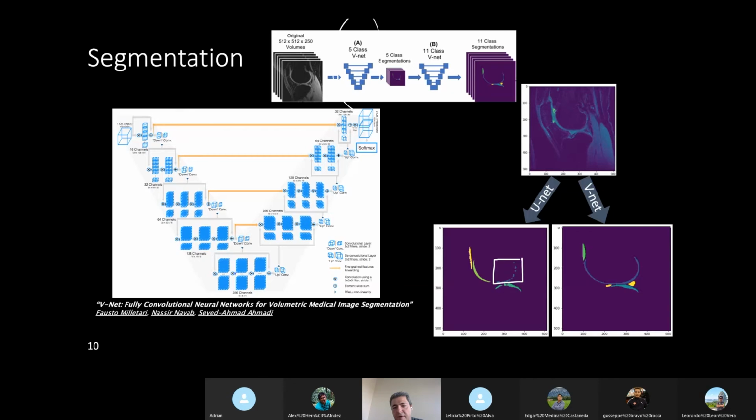But if one pixel in the patella is labeled by the model as femur, then the bounding box would be something like this. And then in the preprocessing part, I would do resizing, and it would screw up the whole resolution of the image, and things would not work. That's a very serious problem.